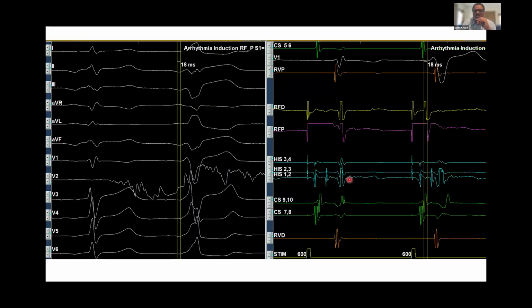All of these happening in a sequence tell us this atrial pacing resulted in a ventricular event with a similar right bundle morphology, but there is no pre-excitation here. So if this happened as a result of ablation, we could say we have been able to get rid of the pathway conduction.